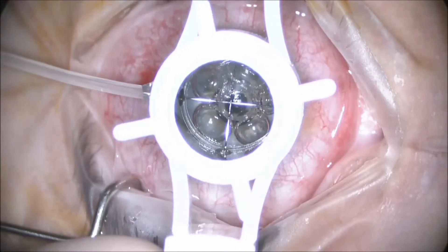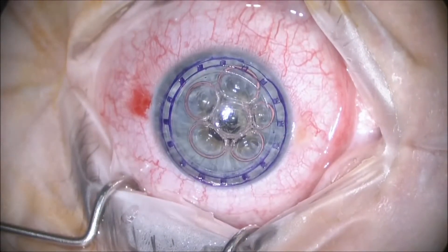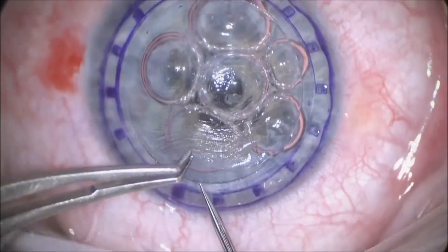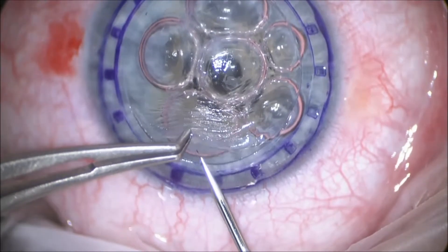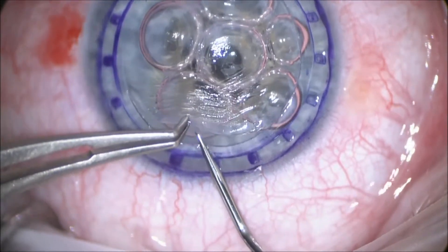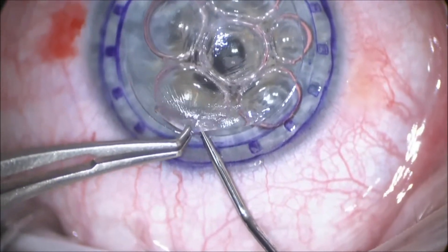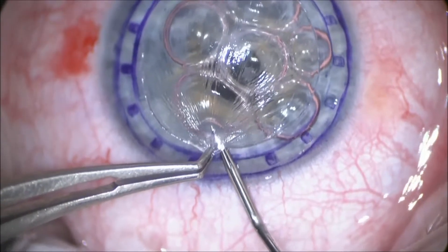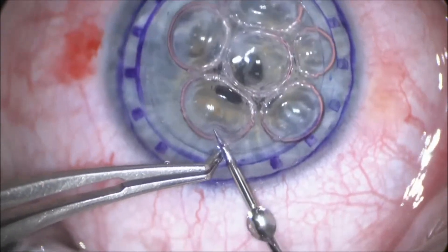We trephinate partial thickness into the cornea. Then here, using a Fogla pin, we create a channel through which we're going to inject air to separate Descemet's membrane.